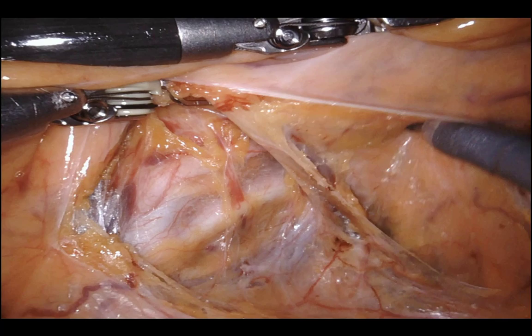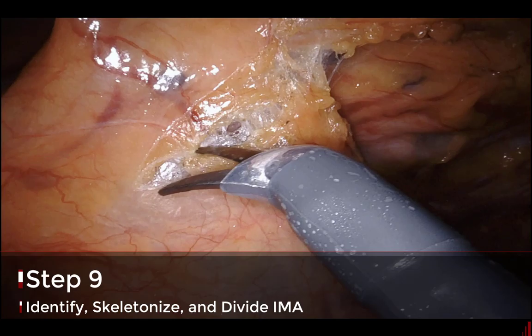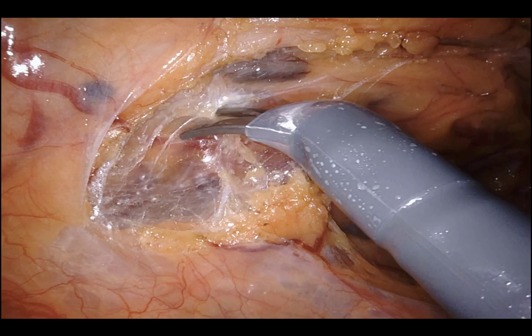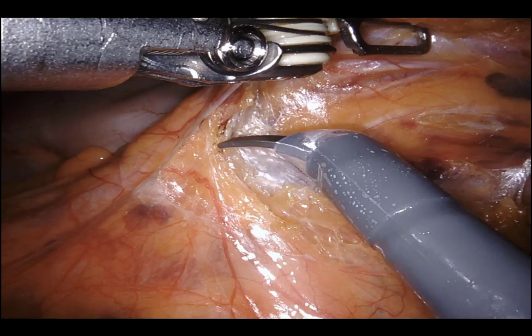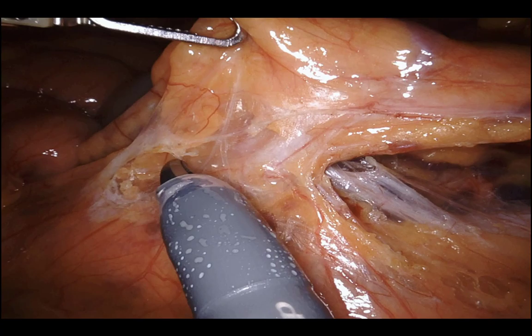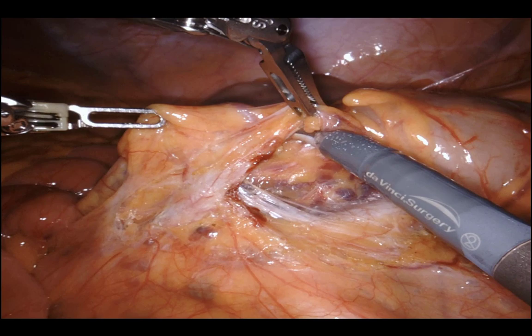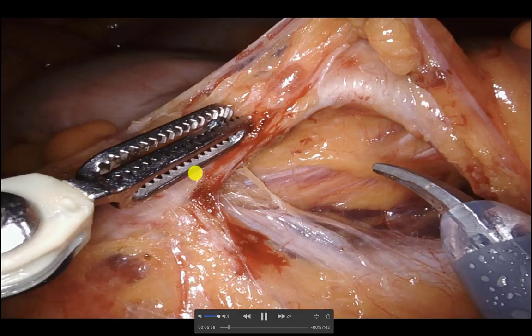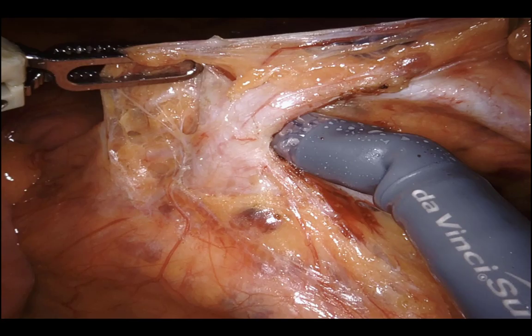I'm going all the way to the takeoff of the IMA from the aorta, speeding up the video. I exchange the third arm to lift the dissection point, keep moving proximally, taking down embryological attachments, peeling the IMA off the retroperitoneum and aorta. I'm looking for the T-shaped takeoff — the aorta is the base, the IMA is the stem, the superior hemorrhoidal heads right and the left colic heads left. I'm creating a window around the IMA pedicle with scissors.